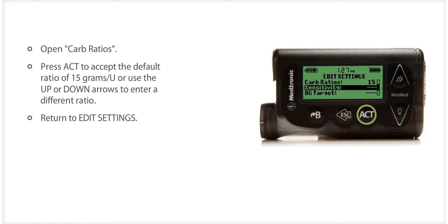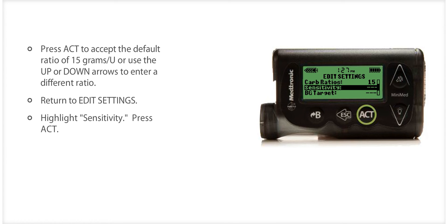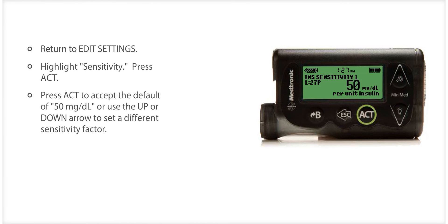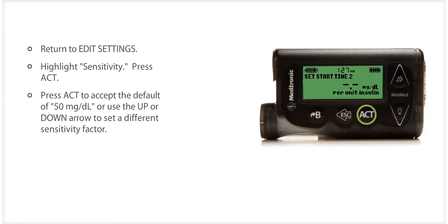Press ACT to return to the Edit Settings screen. The next factor that needs to be programmed is insulin sensitivity. Your insulin sensitivity factor is the number of points, or milligrams per deciliter, one unit of insulin lowers your blood glucose. You can program up to eight different insulin sensitivity factors for different times of the day. For this training, we'll program only one. Scroll down to select Sensitivity and press ACT. Enter the practice value — for this example, we will use 50 milligrams per deciliter. Press ACT. If the sensitivity factor is outside the typical range of 20 to 100 milligrams per deciliter, a message will appear. You can press ESC to correct the value or ACT to continue and confirm the value.